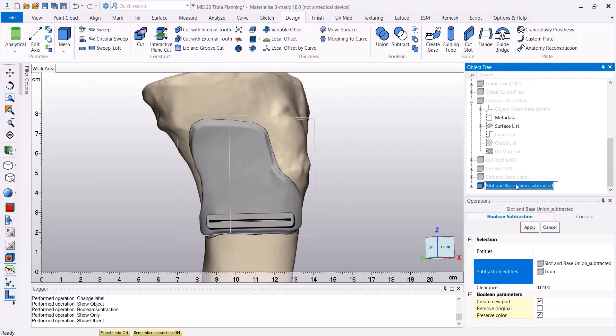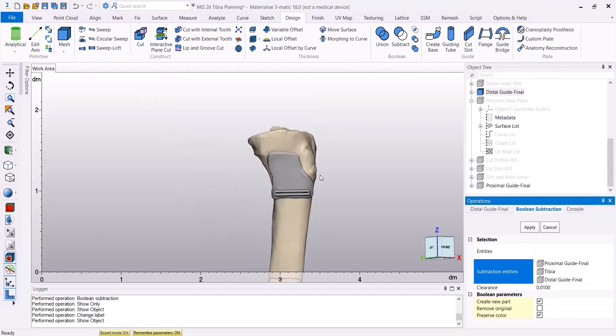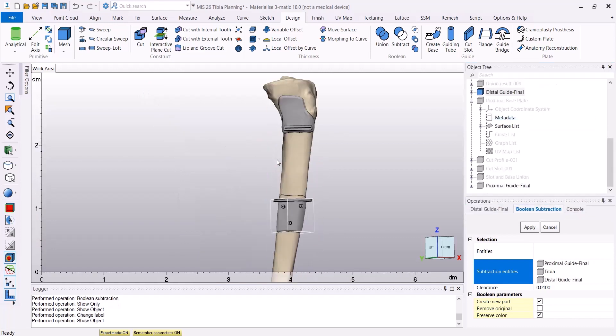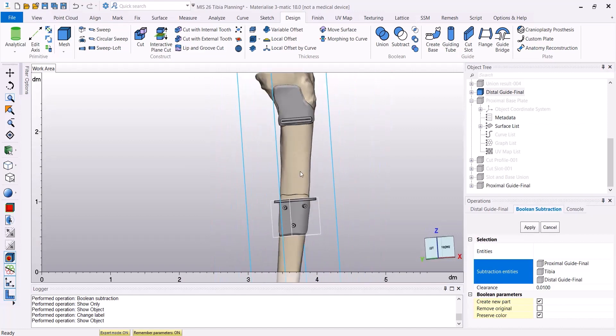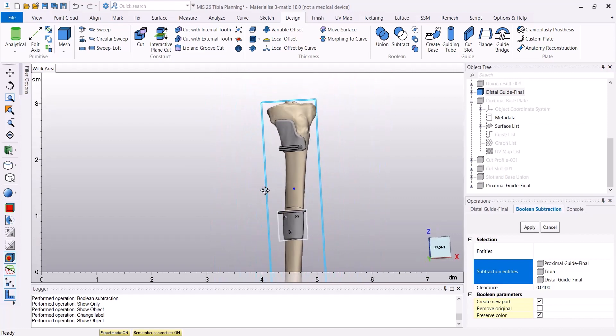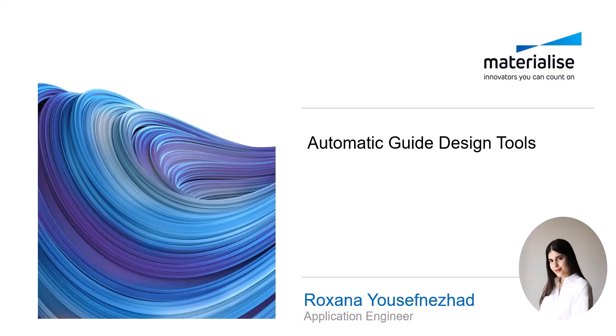Guiding tubes can also be created on the second guide base that I just showed you as it was shown before for the distal guide base. And this will be the final result. I hope you enjoyed watching this video.